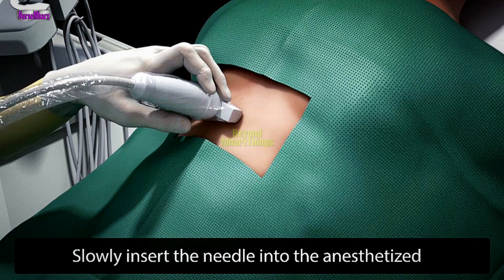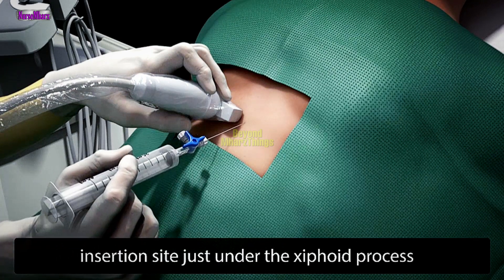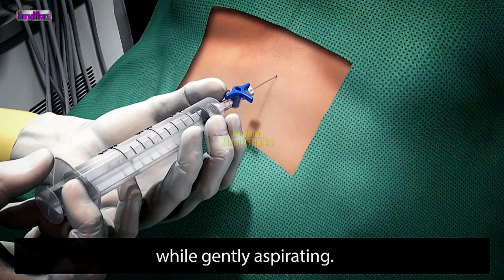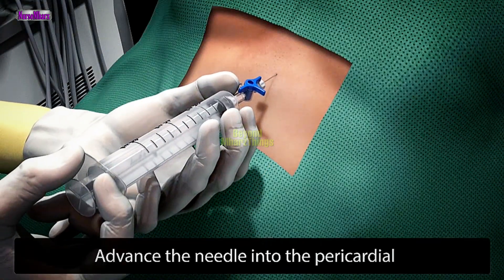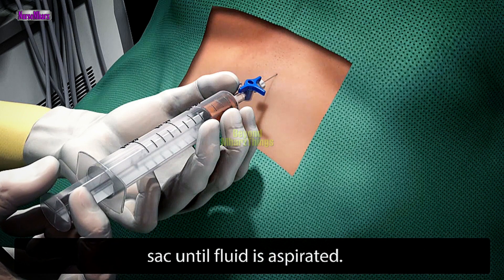Slowly insert the needle into the anesthetized insertion site just under the xiphoid process while gently aspirating. Advance the needle into the pericardial sac until fluid is aspirated.